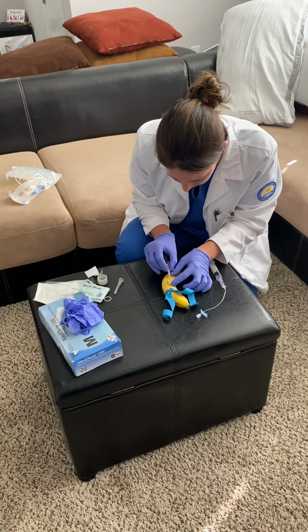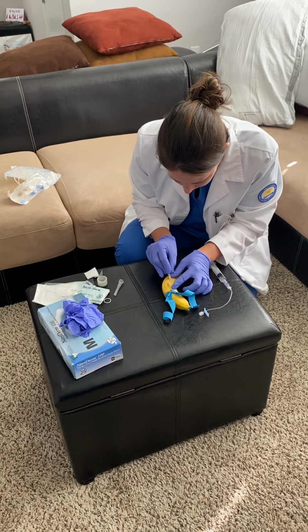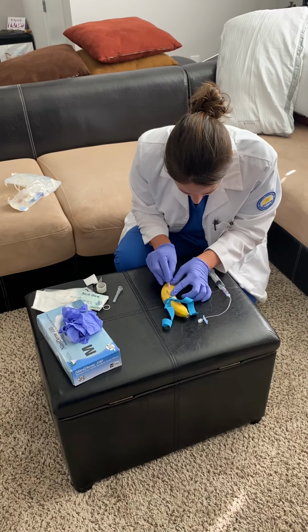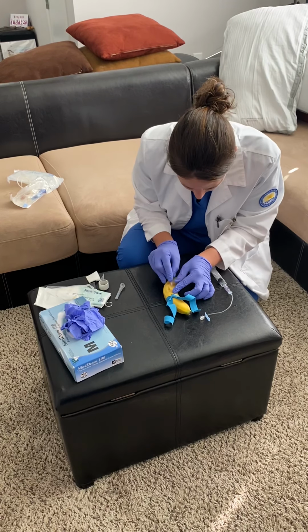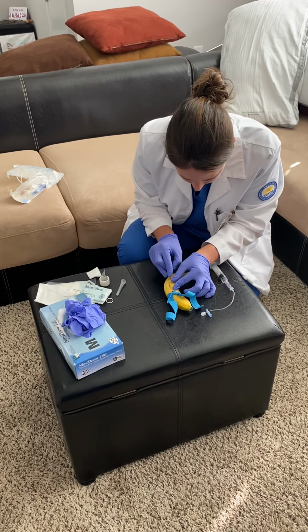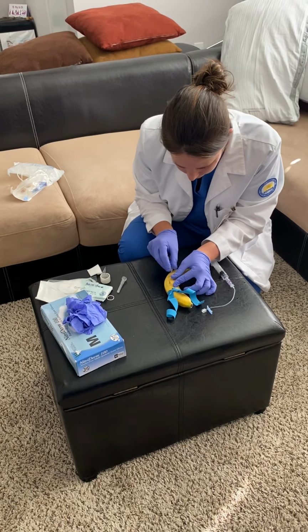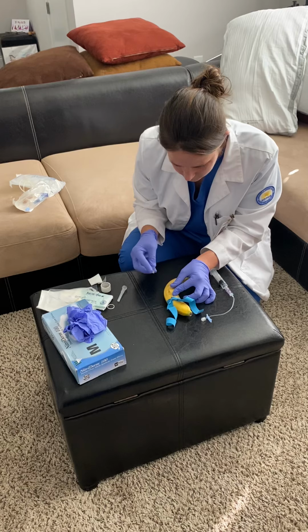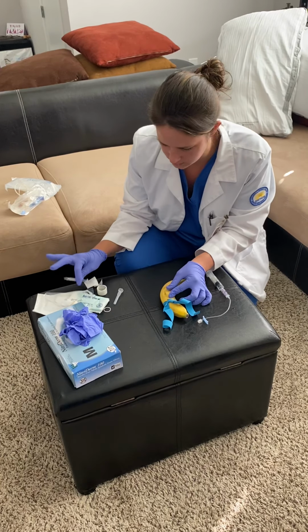Once you see the flashback, you can go ahead and insert the catheter. And gently pull back. And using the safety mechanism, it clicks, I would place this in the sharps container.